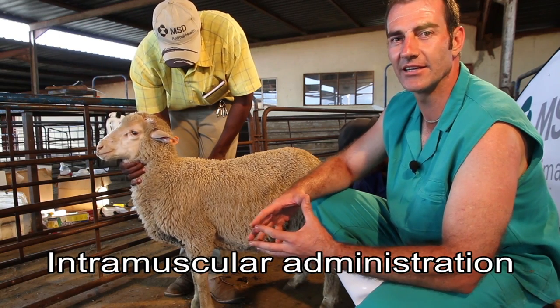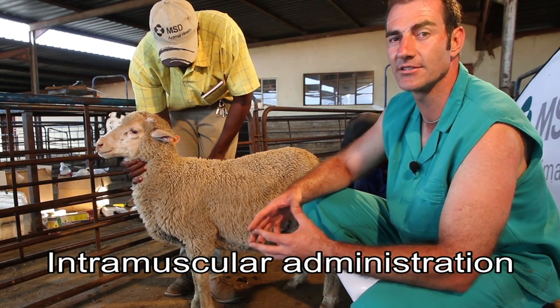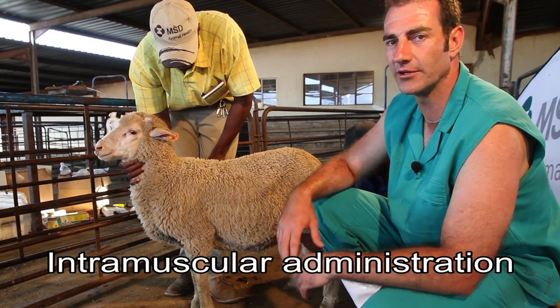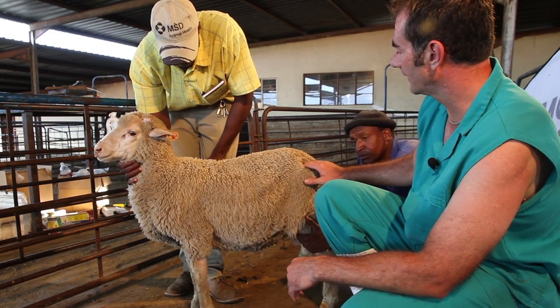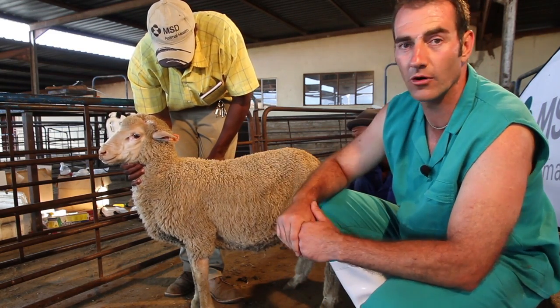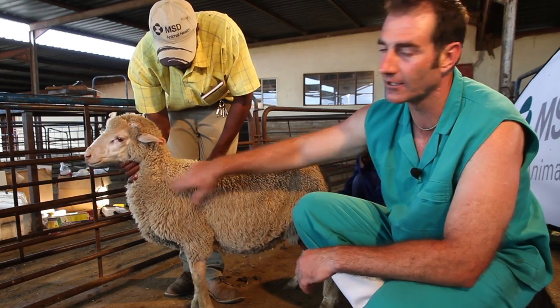The next technique I'm going to discuss is intramuscular injection in the sheep. Two areas are commonly used: the buttocks area and the neck area. More commonly used is the neck area.